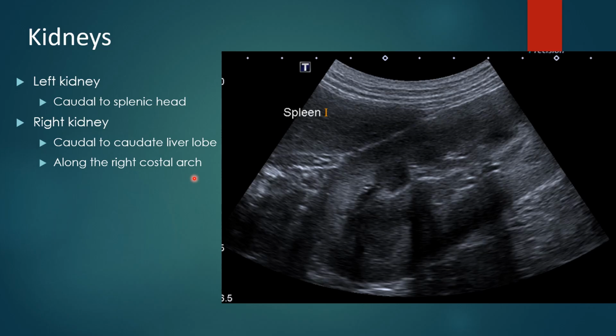Remember, your probe is kind of like a flashlight, so you might be placing it over in the right area, but if you're pointing across the abdomen, you're not going to see kidney, you're going to see intestines. So remember where it's located, and if you have to stop and actually look at where you're pointing on the animal, that can be quite helpful.